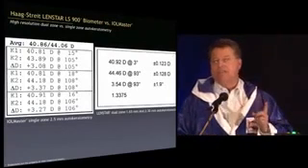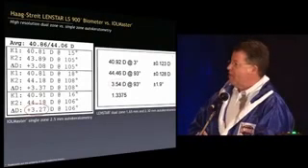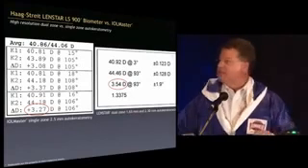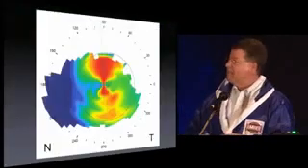This is the last patient I did before I came here for a toric IOL. So here's IOLMaster, here's LENSTAR. Quarter diopter difference, not much difference, and I hear this all the time. But look at the axis. The axis is quite different. So, why does that matter?